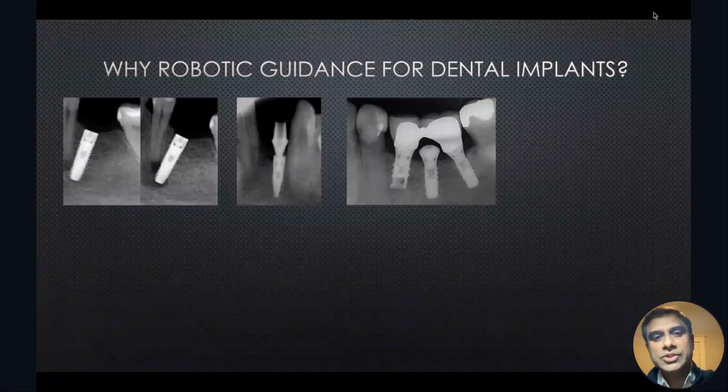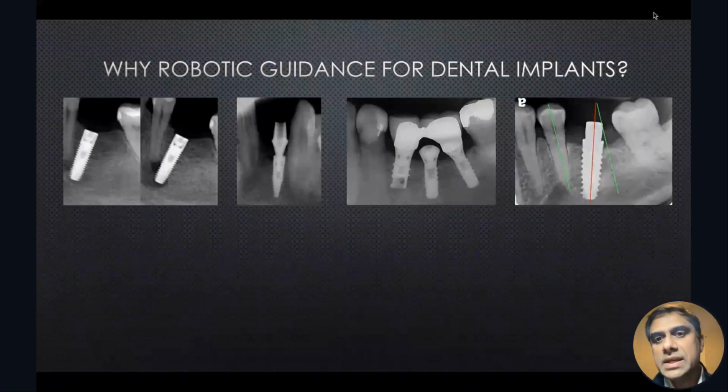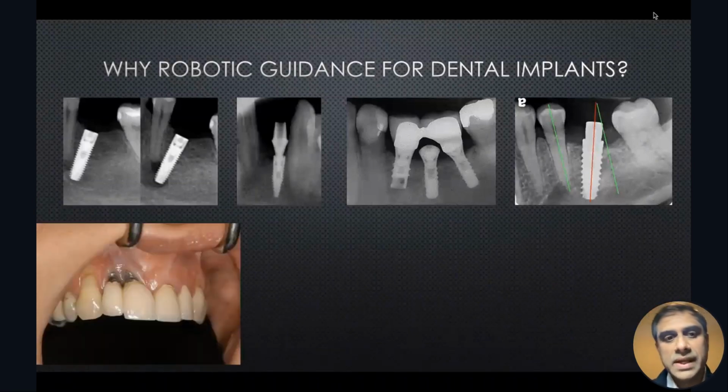So the slides that are showing up here are all true cases that I have seen in my practice, that I get to take a look at, and I'm like, okay, I don't think I can really restore those implants.